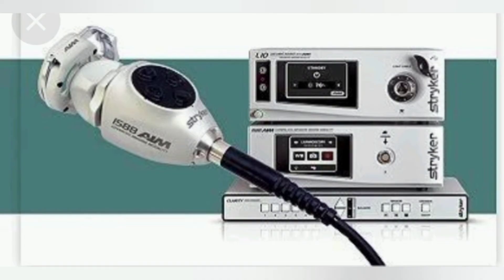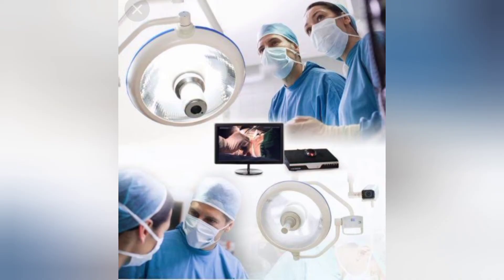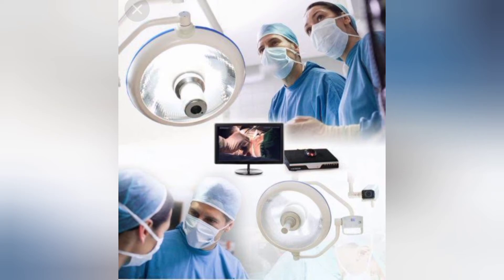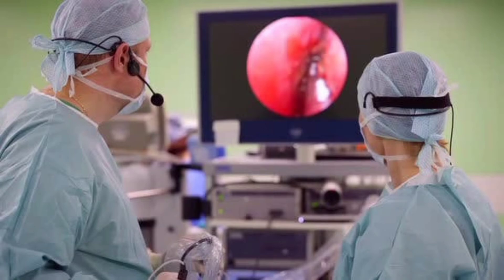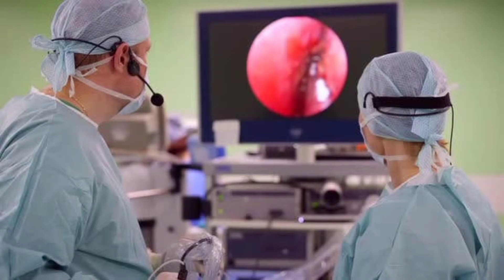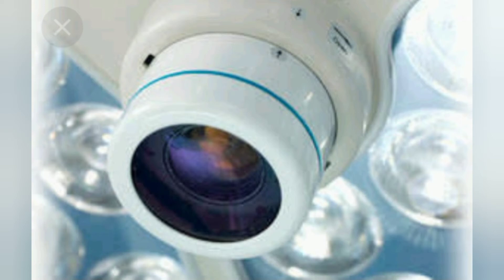The next equipment is the camera system. In the last 10 years, this system has become a very important part of the OT. Sometimes a surgeon needs a very close view of the surgical area to work precisely. The camera system provides that view on an HD screen so that assistant surgeons can also see the view properly. This system also provides the facility of recording the surgery. In this system, the camera is either associated with the OT dome light or is attached to scopes that are in the surgical area.